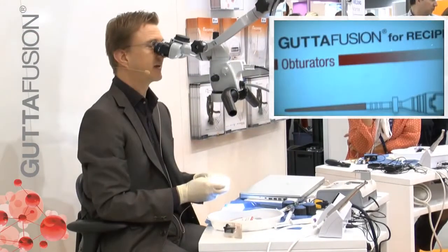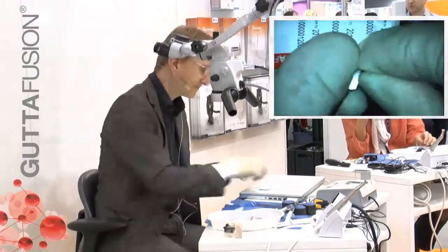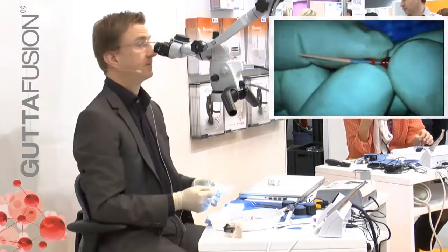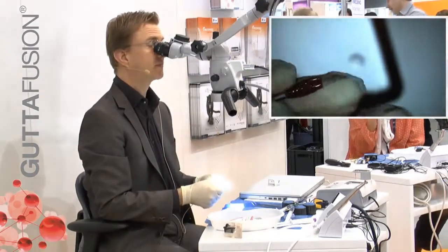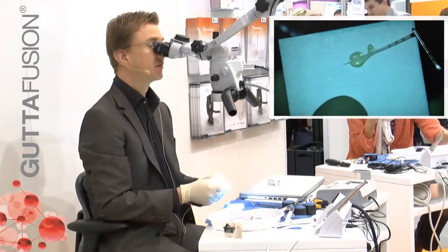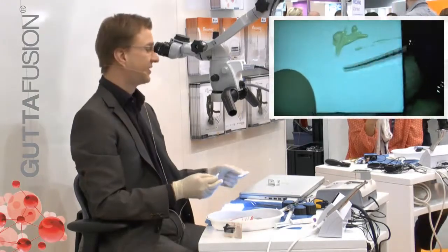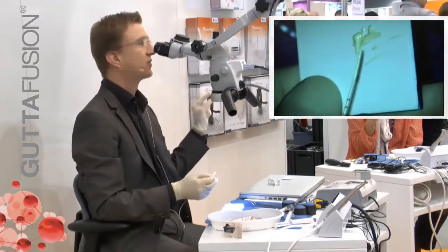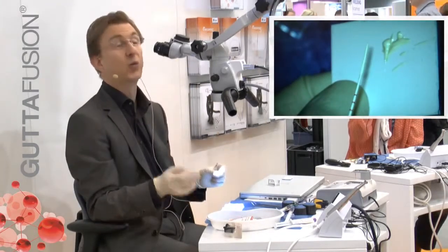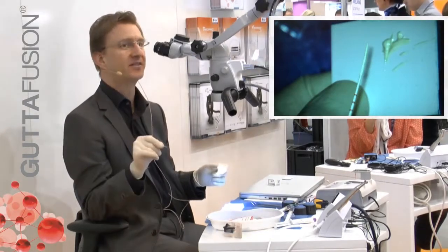And I will demonstrate it to you on one of these plastic blocks. I have chosen the appropriate GuttaFusion obturator, and I take a paper point to insert the sealer. This is the amount of sealer that I actually need. You see, little sealer. The most common mistakes that I see are too much sealer, way too much sealer, and the insertion of the obturator too fast.